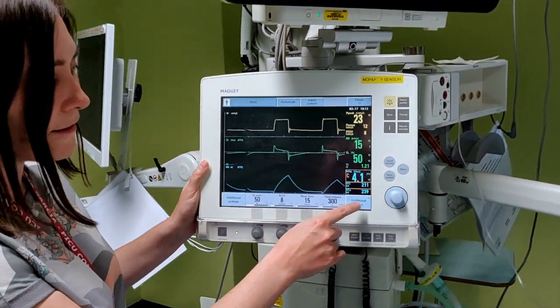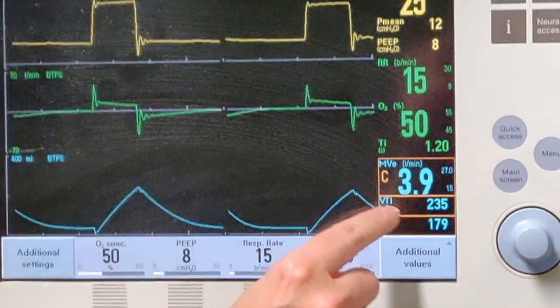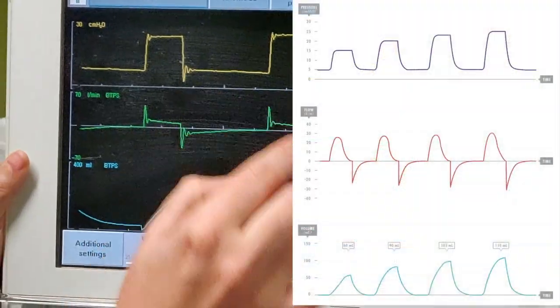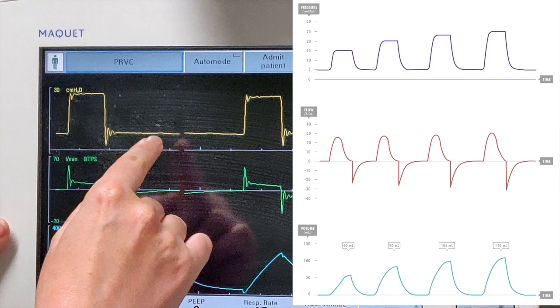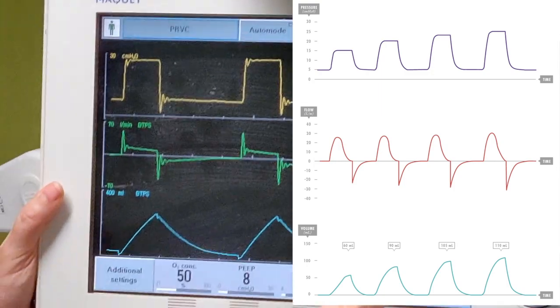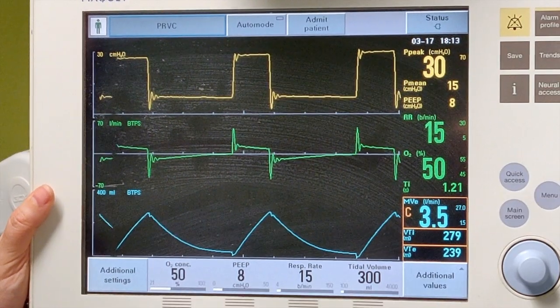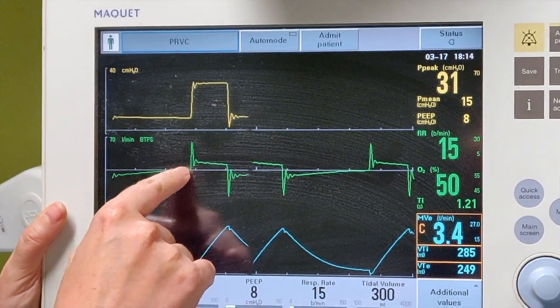We go back to the vent. The ventilator realizes that we're not giving 300. We were giving 200. So it starts increasing the target pressures, the pressures that it's generating, the pressures it's aiming to equalize, up and up and up until it reaches the 300 that we were asking. The other things we are going to see are the same things that we saw earlier.